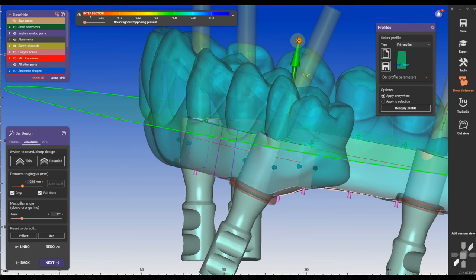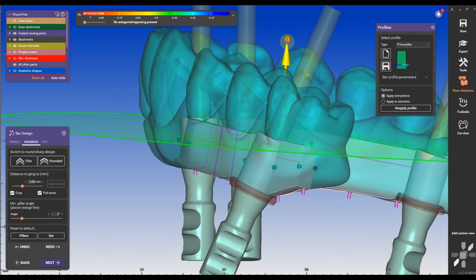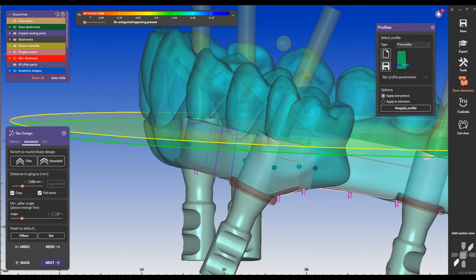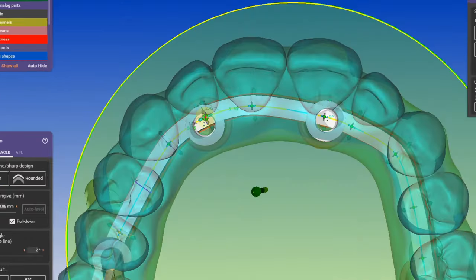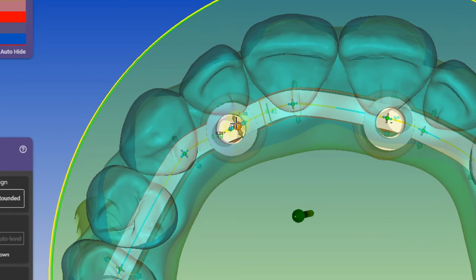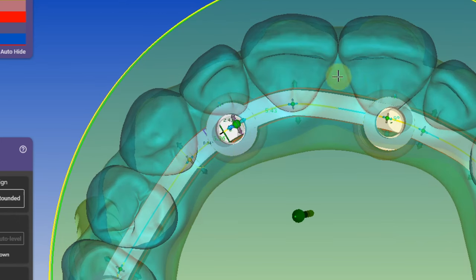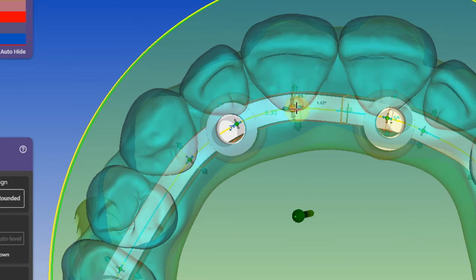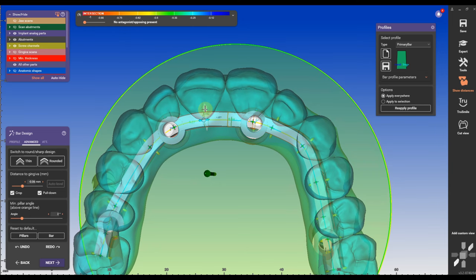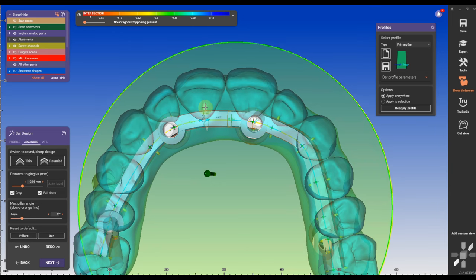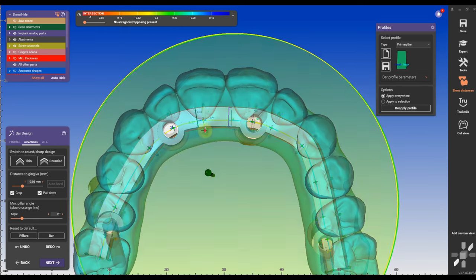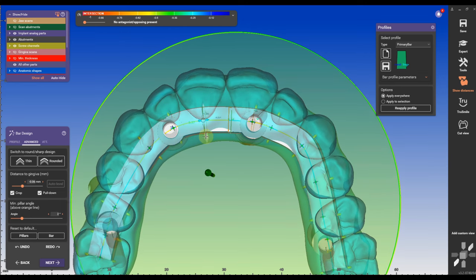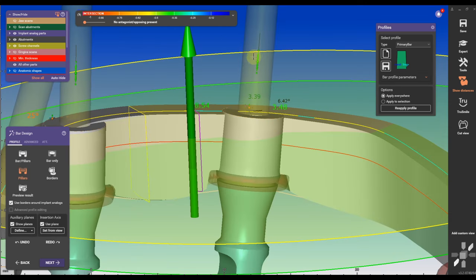I'm going to set the thickness to 0.6 so it intersects a little bit with the gap and that's the only reason why we needed our jaw scan. I'm going to move the bar about in the middle of the pillars and it depends on the case. I'm going to make it a little bit thicker, hold control here, get the pillars a little bit down to the same edge.